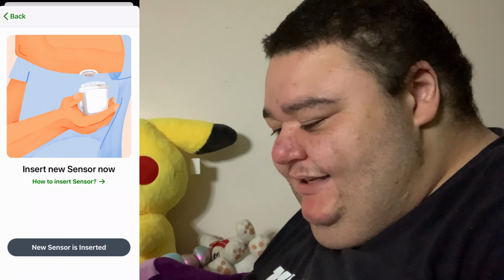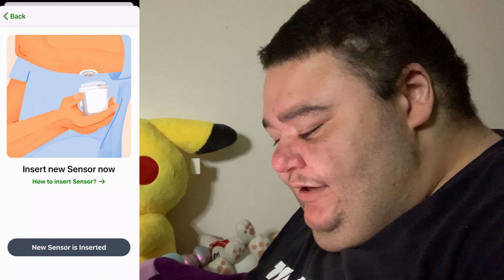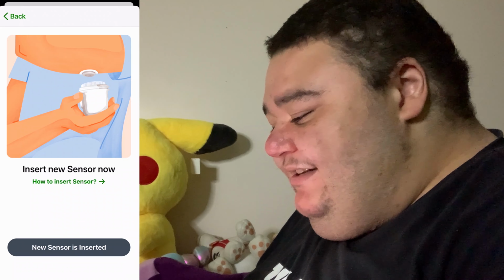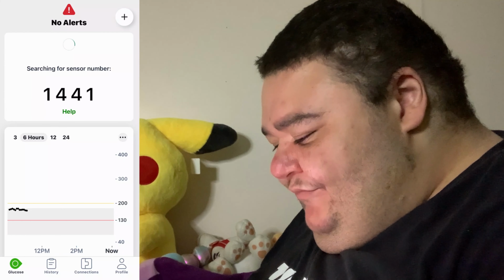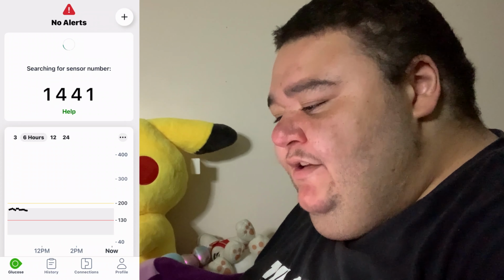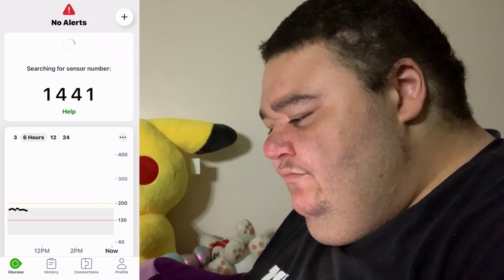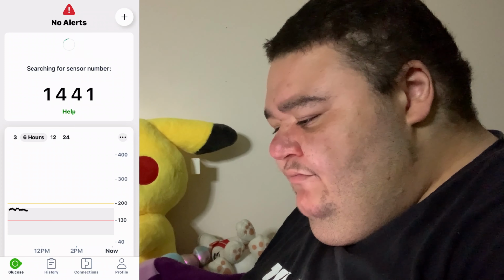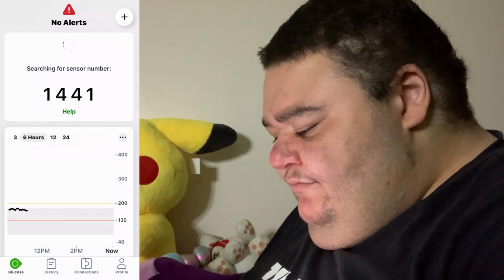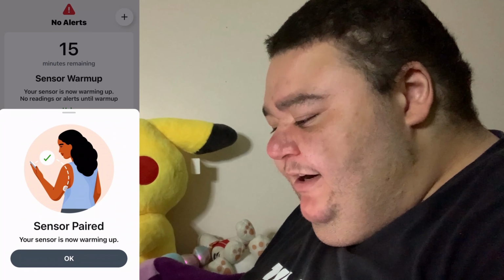Once this gets through, it's going to do all the process again here: insert the new sensor, make sure everything is accurate, make sure the sensor is within 3 feet. All that process, you guys will see it. Once this loads, searching for sensor number.